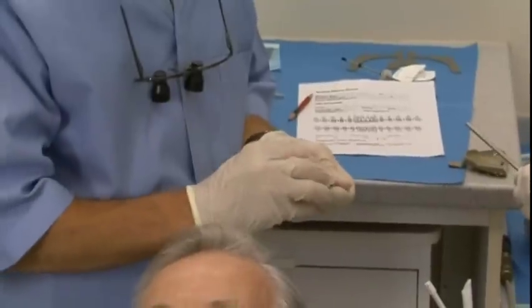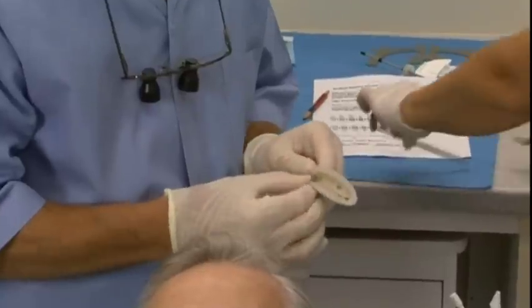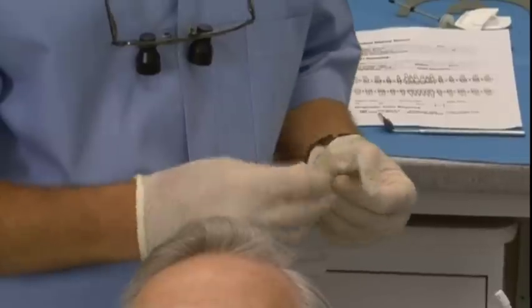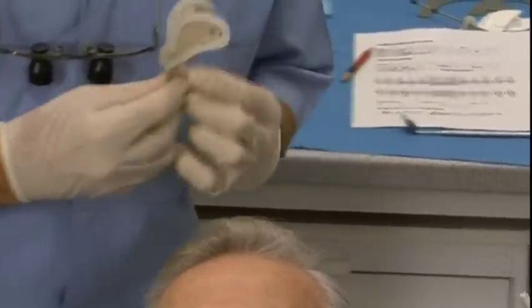This is a four-handed procedure because you have to mix two different bodies of impression material and then be loading the tray and loading the syringe at the same time.